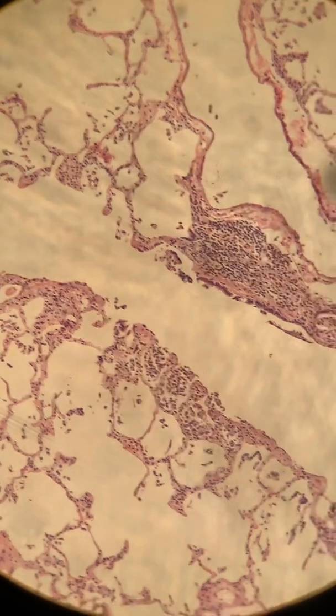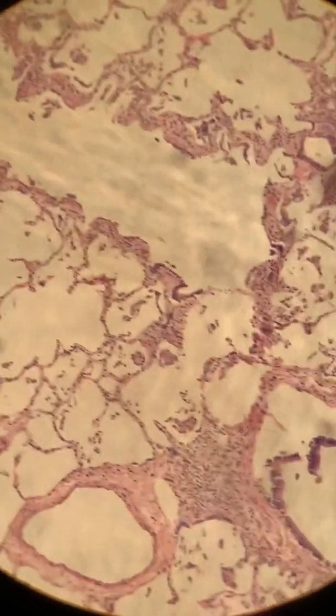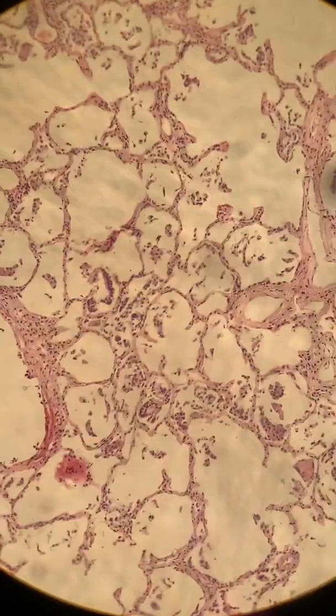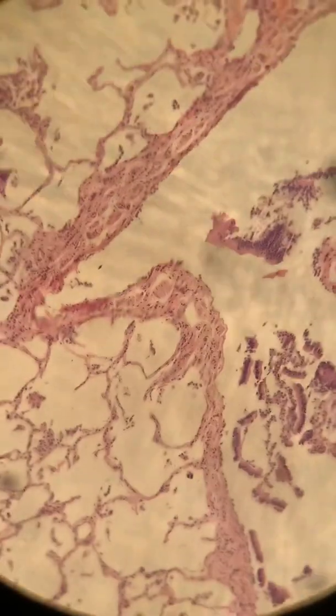So on this image, you can see this is another slide showing clearly inflammatory cells within the alveolar spaces. I'm just going to stay on the low power so you can see more of the inflammation, and then we'll go down. But this obviously was an early infection. As you can see, it's not rip-roaring acute inflammation. In some areas there is more inflammation than others.